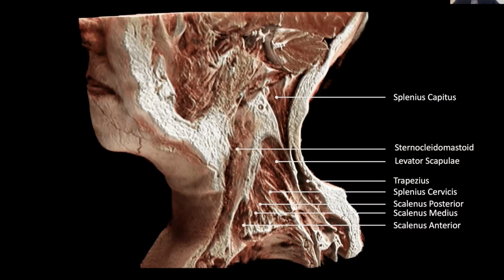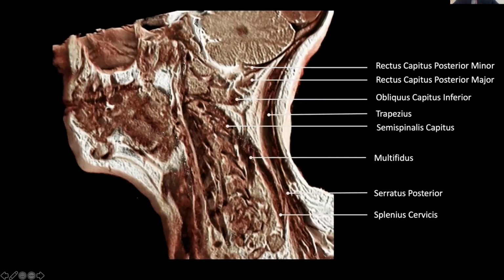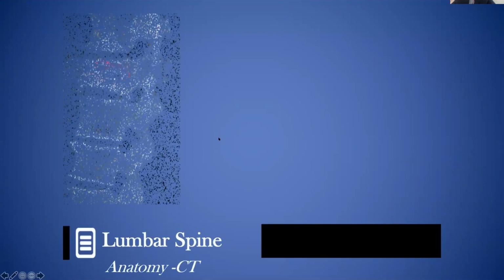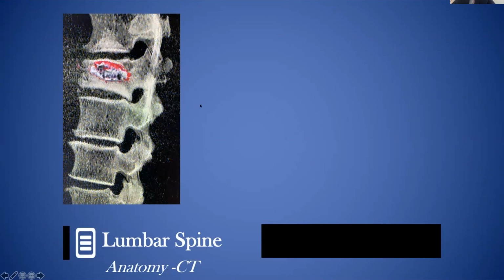So you learn something in anatomy class in a 3D perceptual holistic environment, and then you work your way back to cross-sectional imaging, and then from cross-sectional imaging to composite imaging like ultrasound or X-ray. Again, just more examples of how we can depict these individual muscle groups. Again, no point in me teaching you how to suck eggs, so to speak. The lumbar spine, very similar situation.